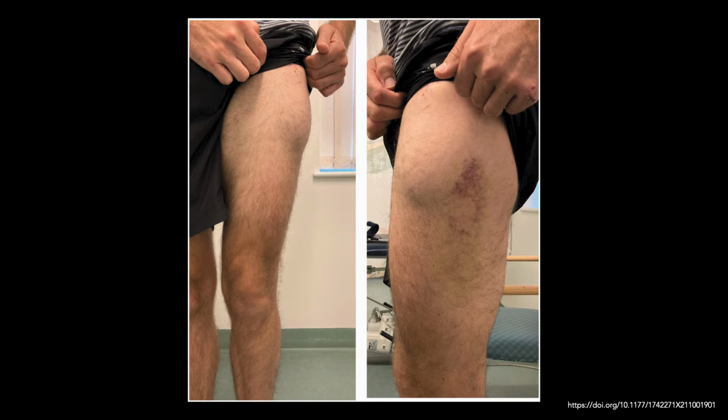So imagine yourself seeing this runner who fell and landed on the side. They're saying, hey, doc, I've got some pain and I've got swelling in the lateral part of my left thigh. The vitals look pretty good and the patient is otherwise well appearing. But when you look at the patient, you notice there is some swelling there. You can see that little lump on the lateral side of the thigh and you can see some ecchymosis. So they definitely took a pretty good tumble. And as the inquisitive POCUS user that you are, you decide to grab your ultrasound and see what is causing this lump that you're looking at.